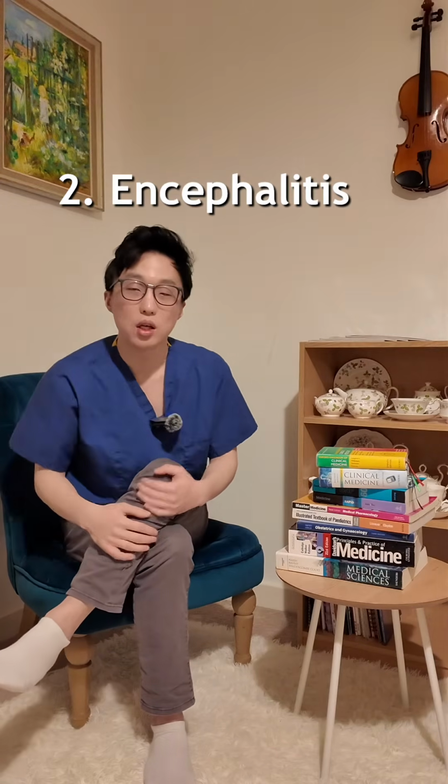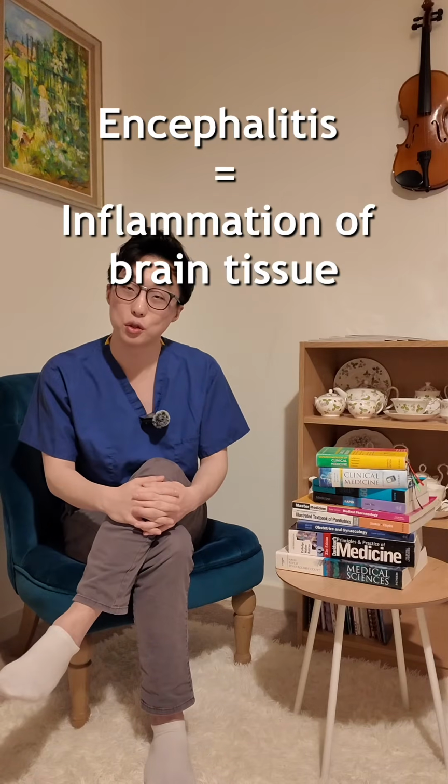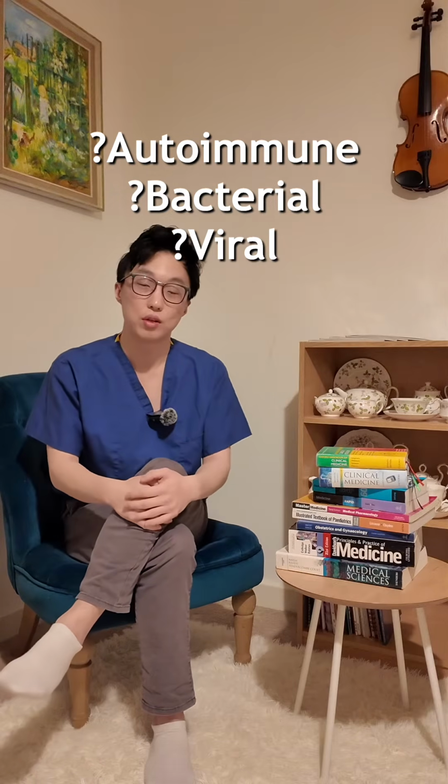Number 2, EEGs can detect encephalitis. Encephalitis means inflammation of the brain tissue, which could be autoimmune, it could be bacterial or viral. EEGs go one step further and tell you what type of encephalitis. For example, the pattern is consistent with an autoimmune limbic encephalitis, HSV encephalitis.